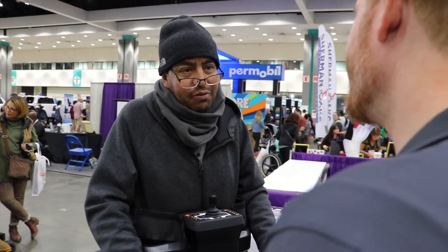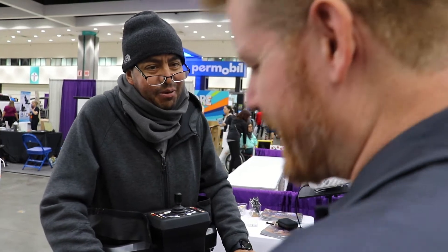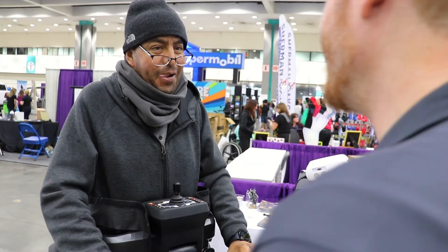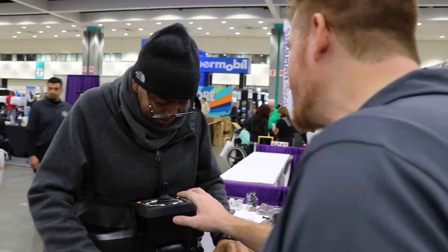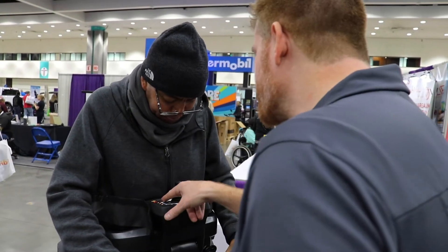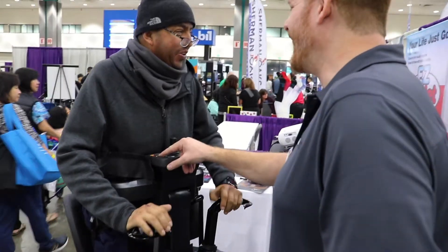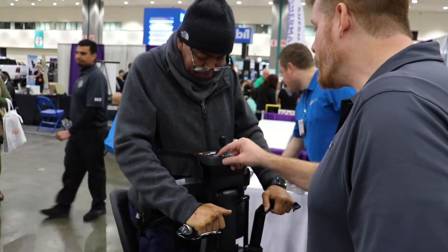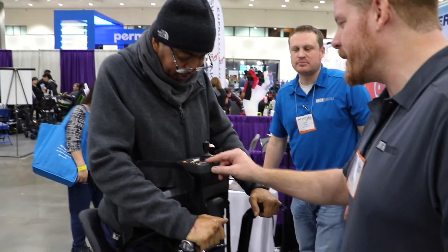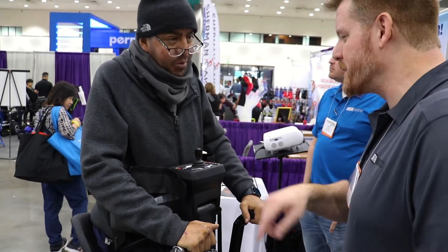I feel like a new man! I'll tell you — 5'11", I'm not big. 5'11", 5'10" — something like that. You're about an inch taller. You're taller, man. I'm 6'1". Alright, so the way you drive it now — we're going to slow this down a little bit here. This is the safe and sane speed, go all the way to the lowest. This is where you want to start. Once you get the hang of things, you can crank it up — oh my gosh, that's crazy fast. But we're going to start at a safe and sane speed because they're not all wearing steel toes.